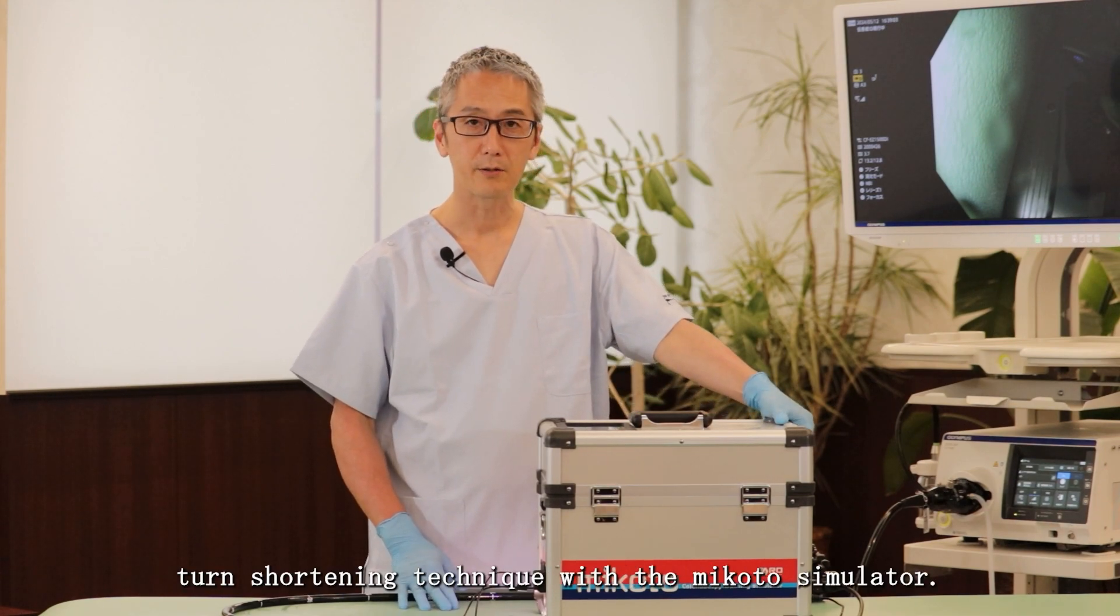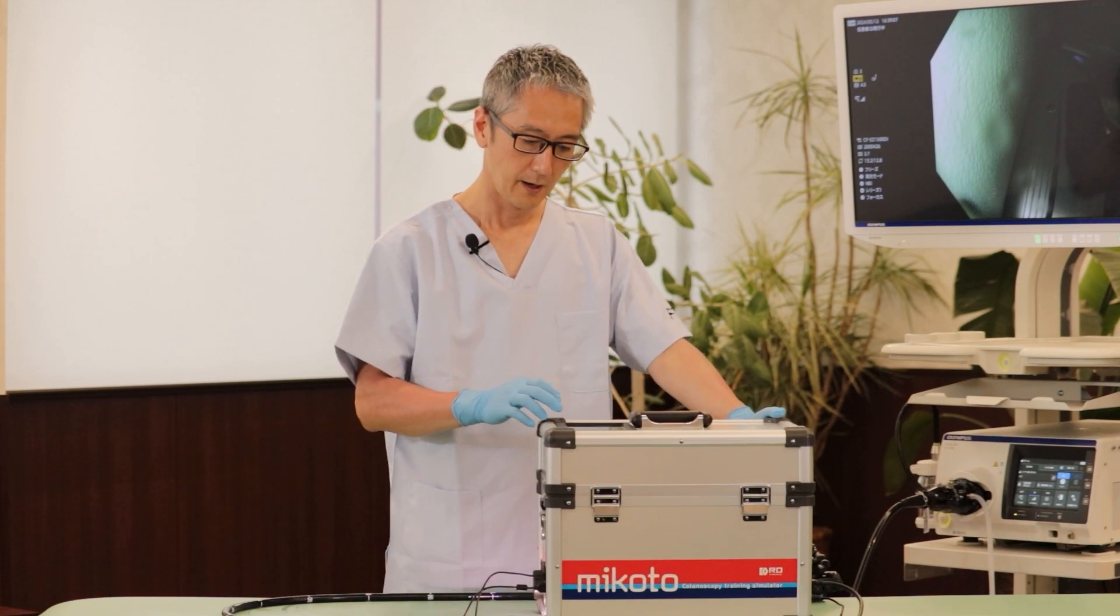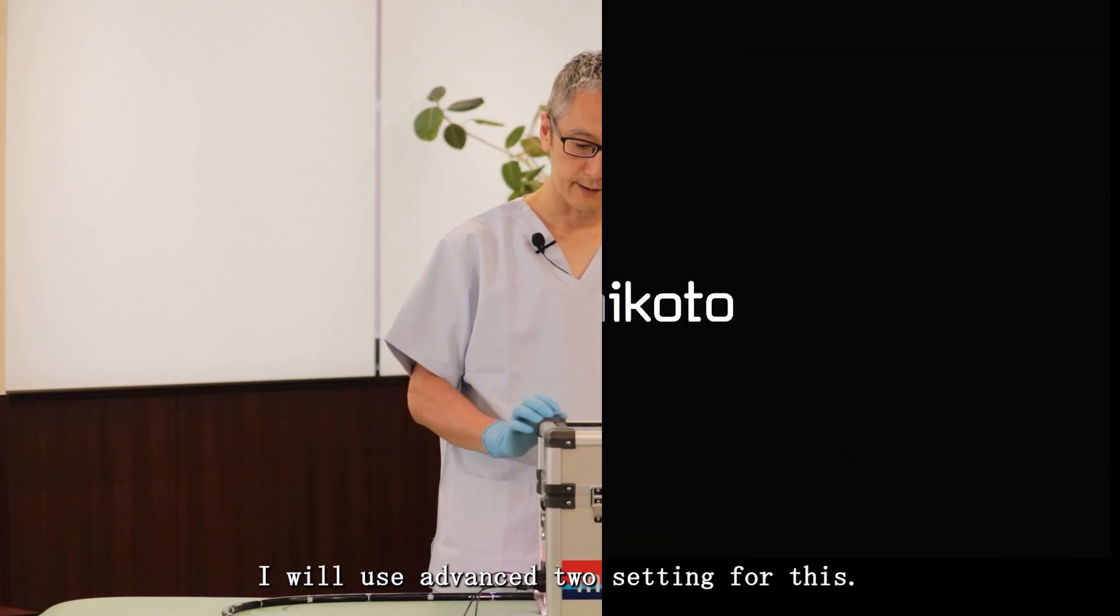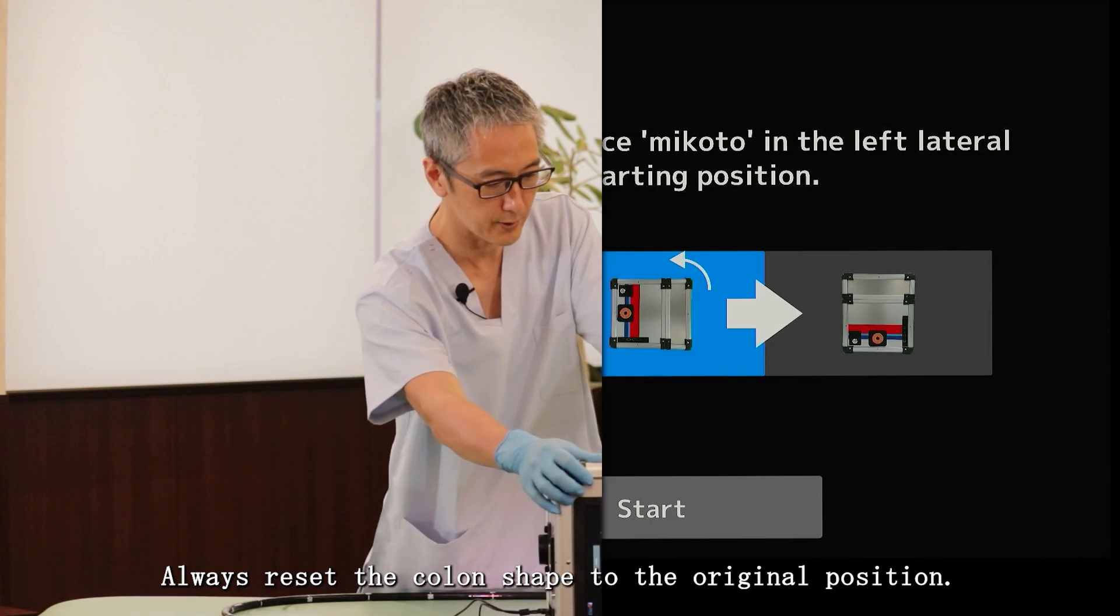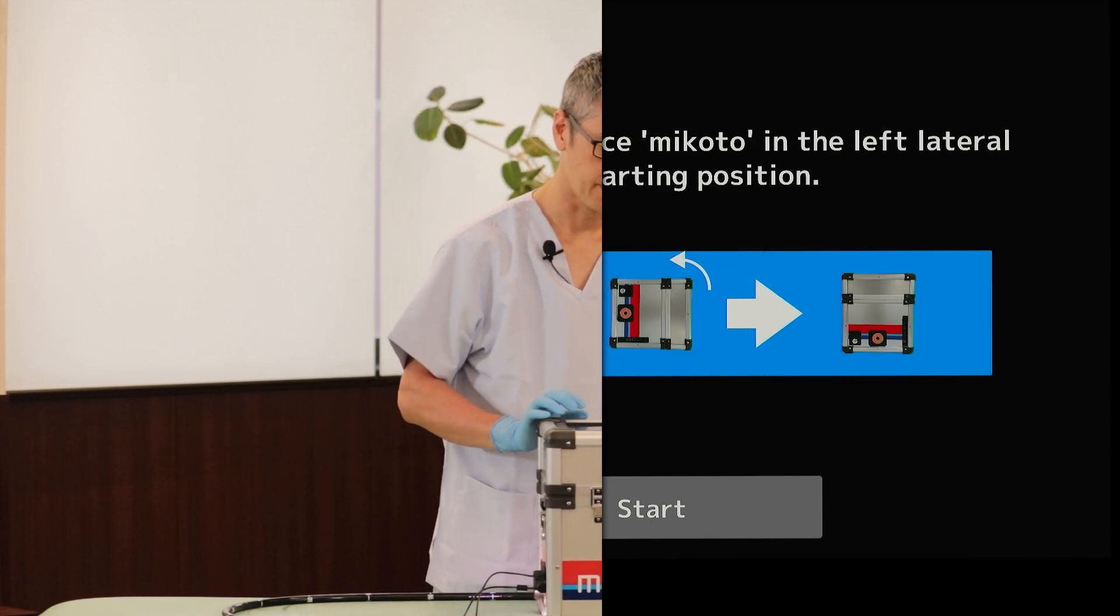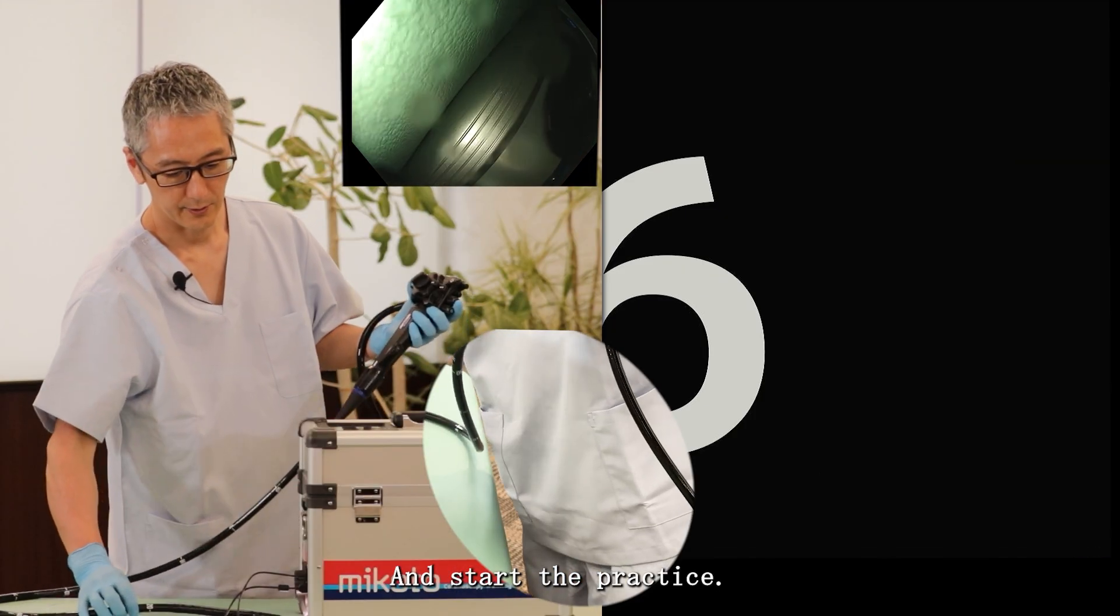Now I will try the right turn shortening technique with the Mikoto simulator. I will use advanced two setting for this. Always reset the colon shape to the original position and start the practice.